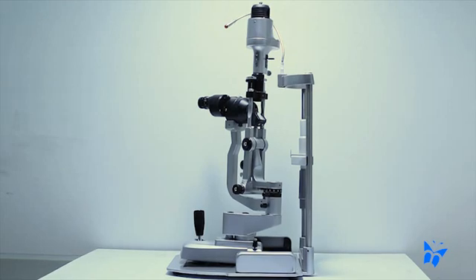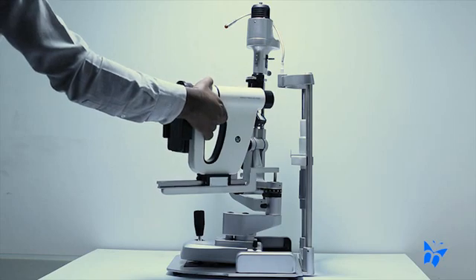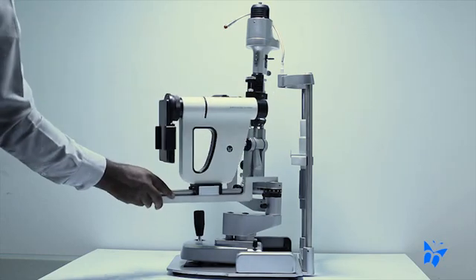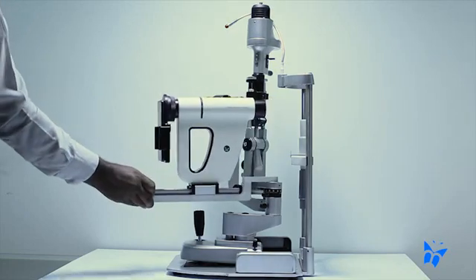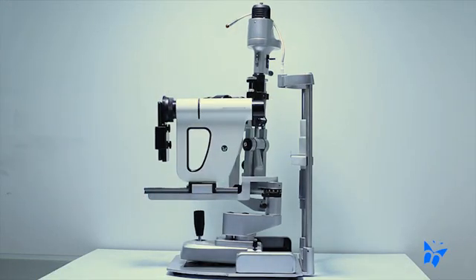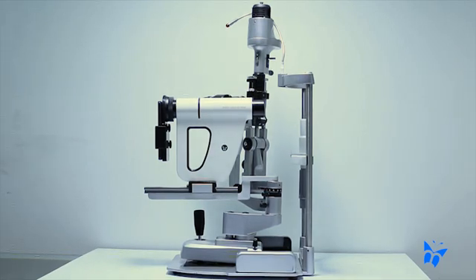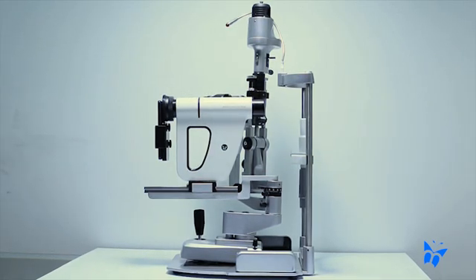The FOP device with the slit lamp attachment fixture may now be inserted into the testing rod hole of the slit lamp. This allows the use of the FOP device on a standard slit lamp, ensuring patient stabilization on the chin rest of the slit lamp prior to taking retinal images using the FOP.